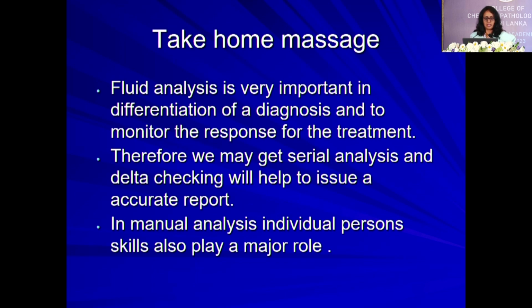With that, which is called delta checking, we will be able to release an accurate report. In manual analysis, individual skills also play a major role.